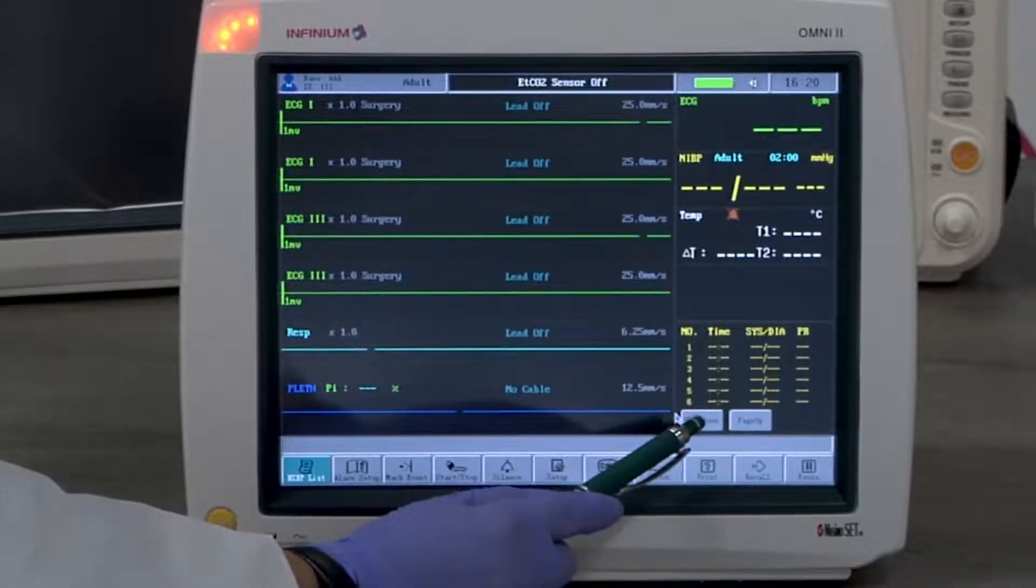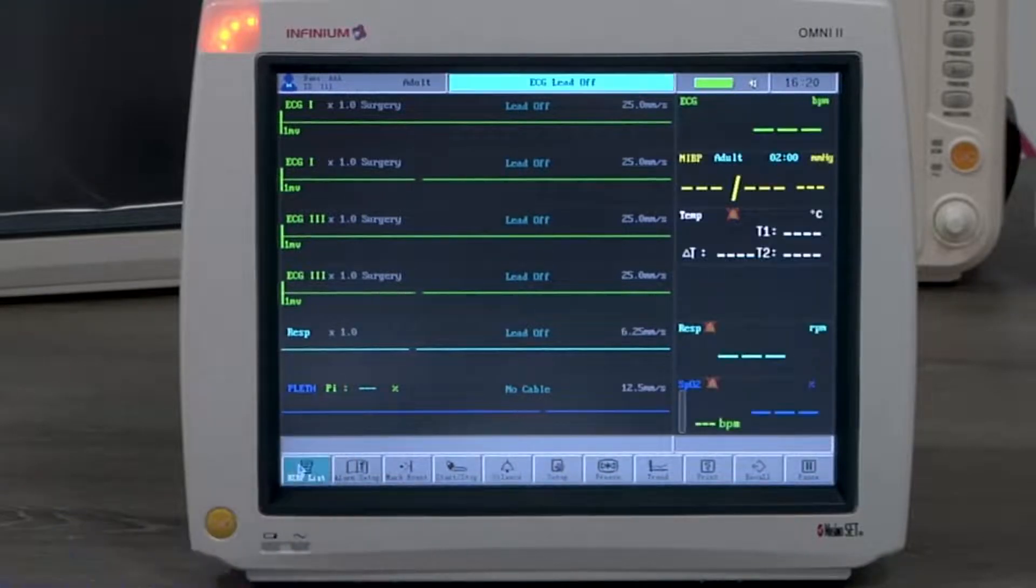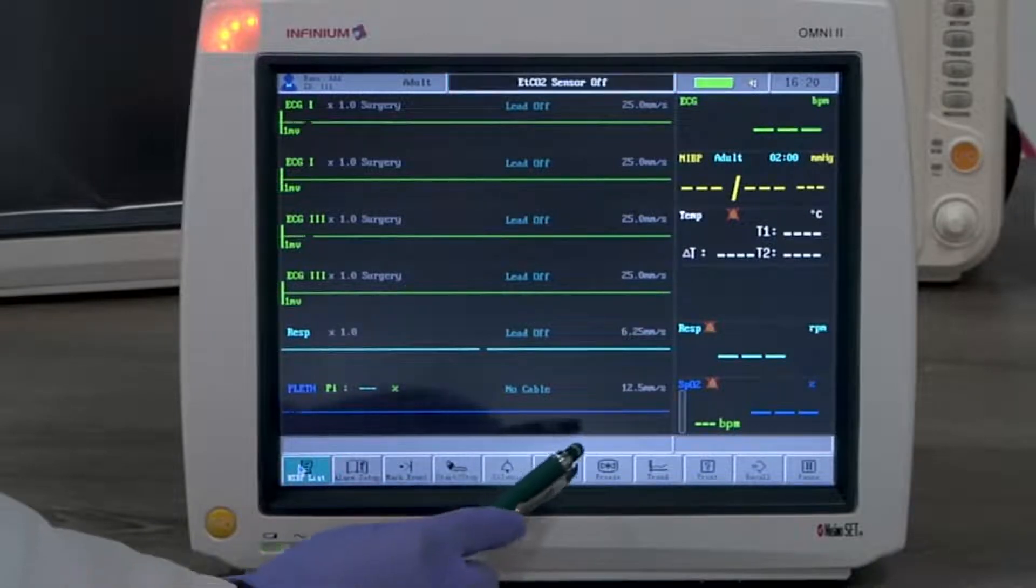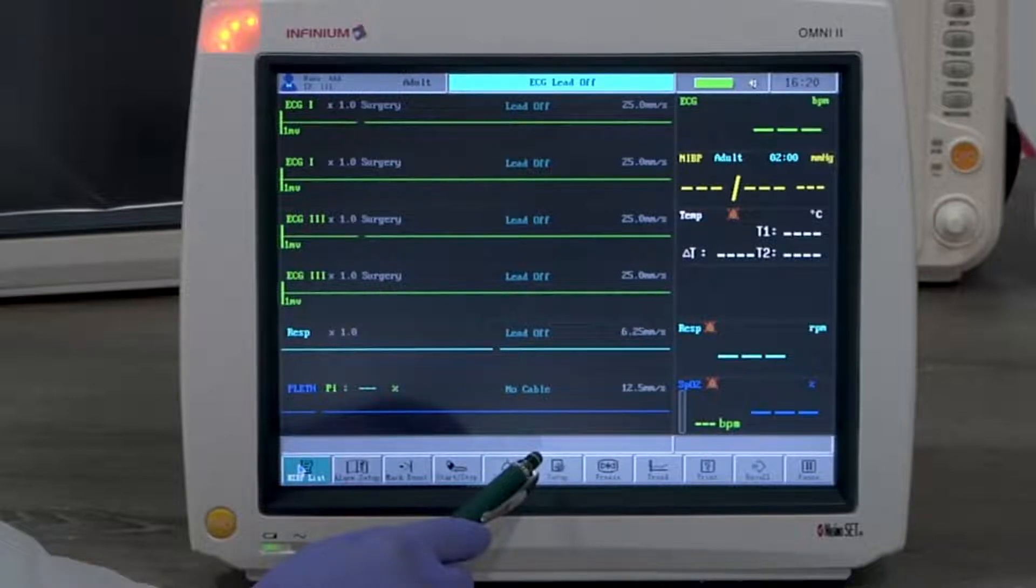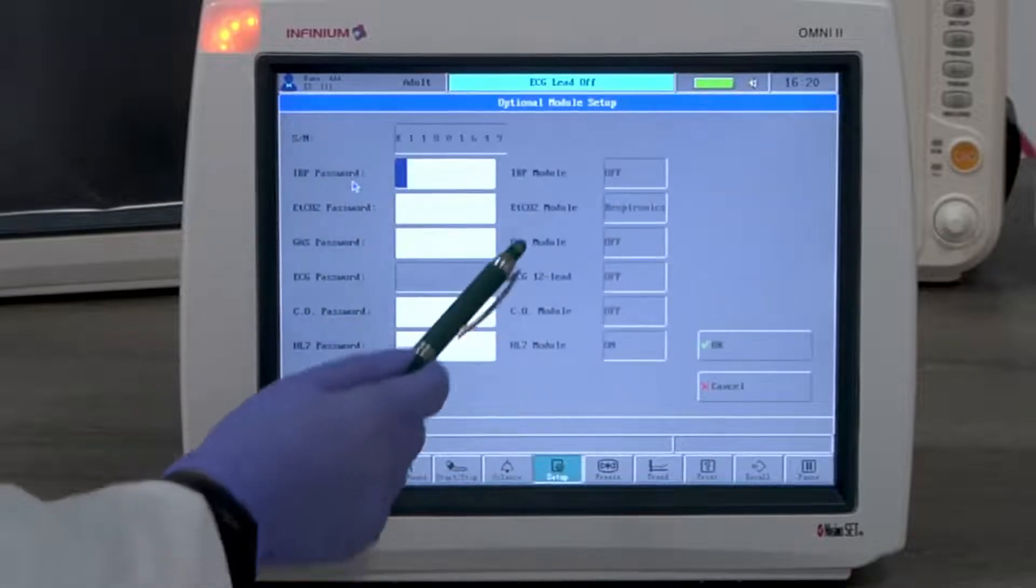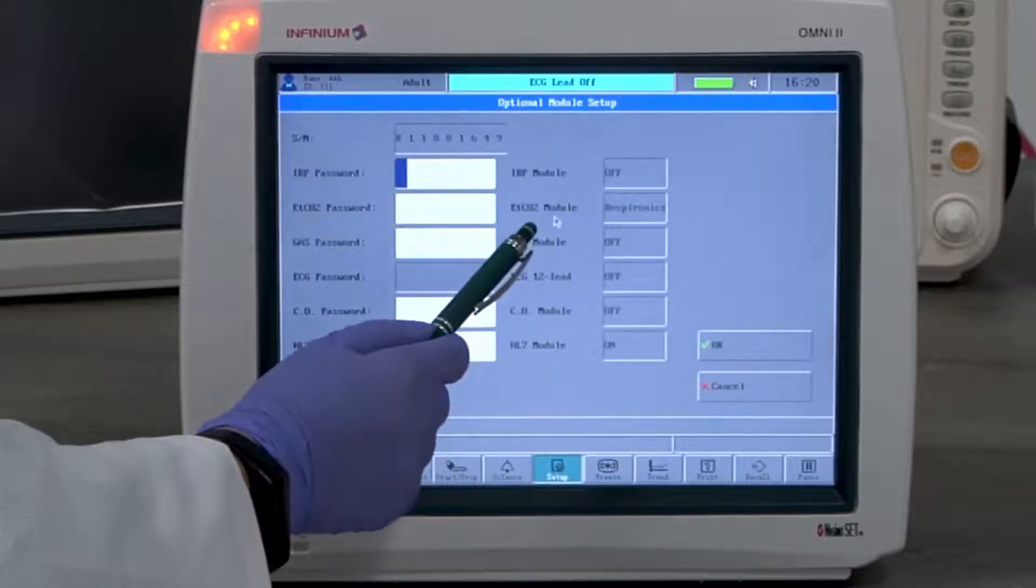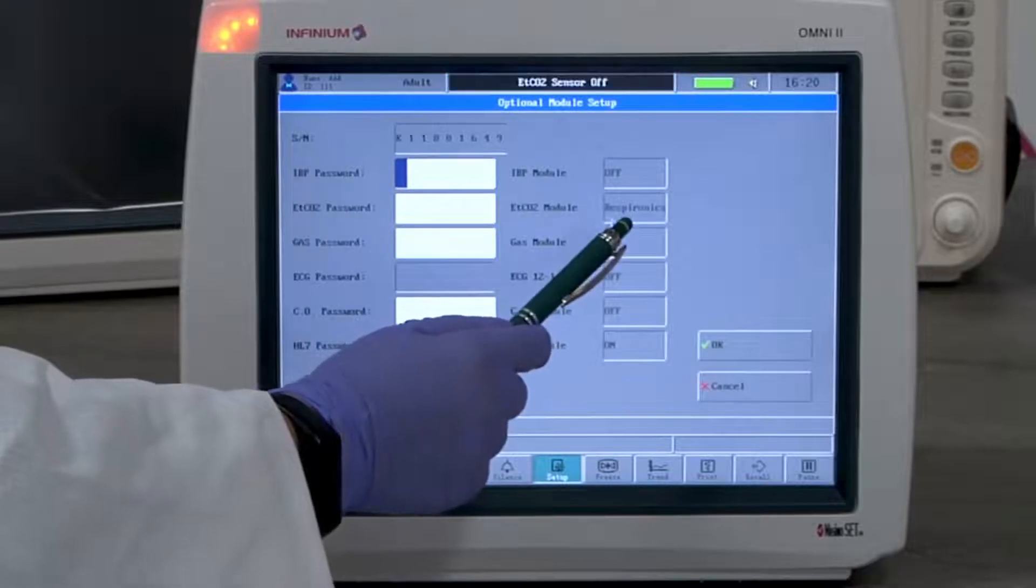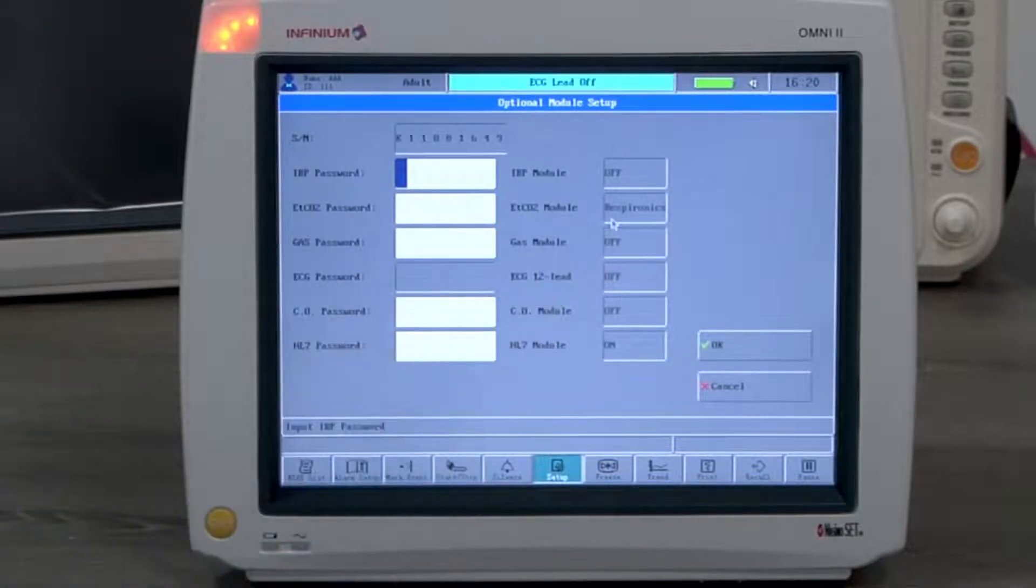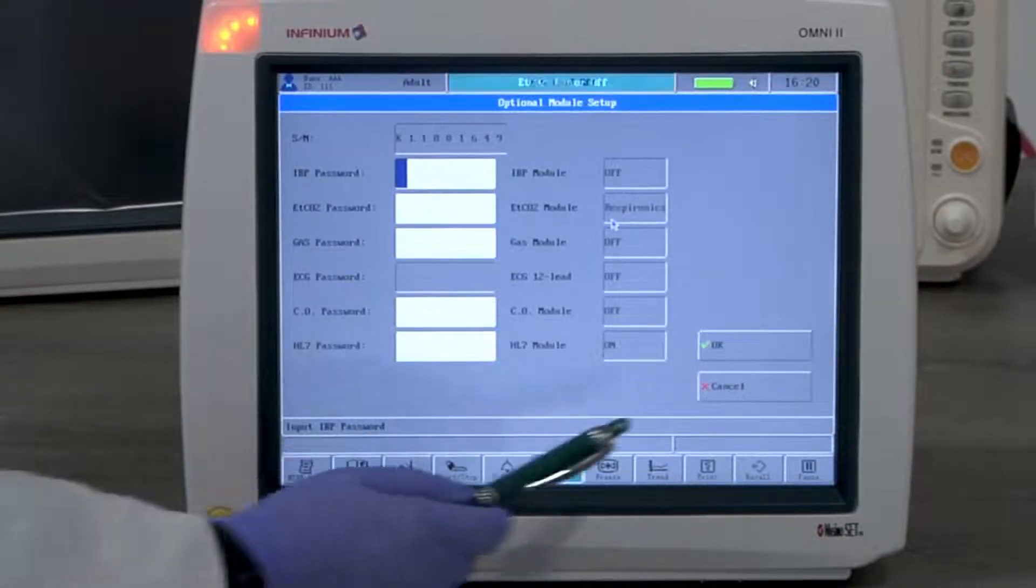Now let's look at ETCO2 monitoring. ETCO2 is an upgradeable feature. It's different. It's off, as are all the options. When it's unlocked, you'll see a CO2 type selected here. This will be either Respironics or Phasein. To avoid confusion, the CO2 channel and respiration channel cannot be displayed at the same time.